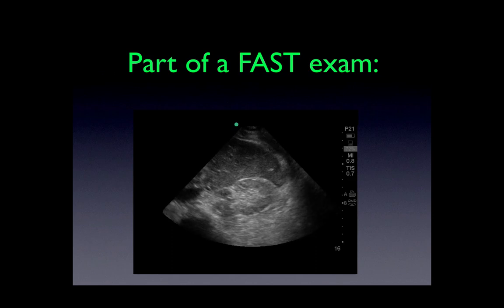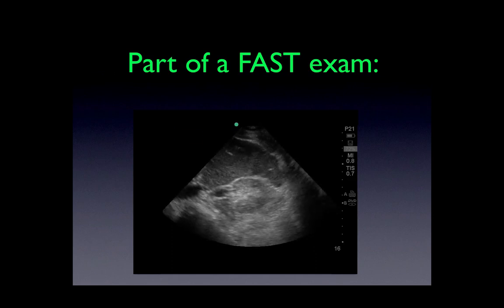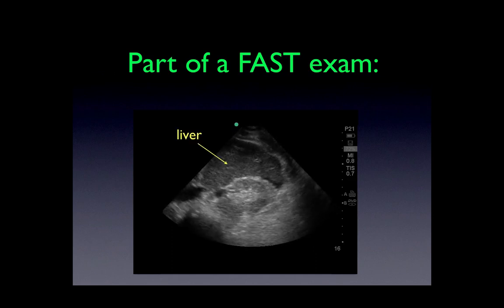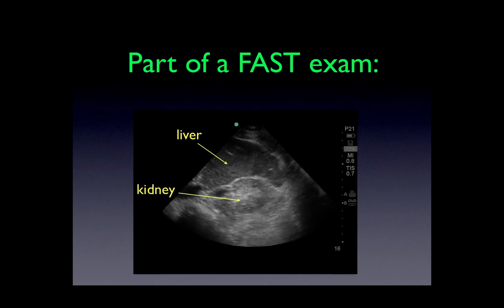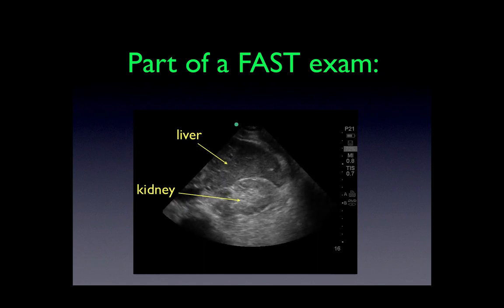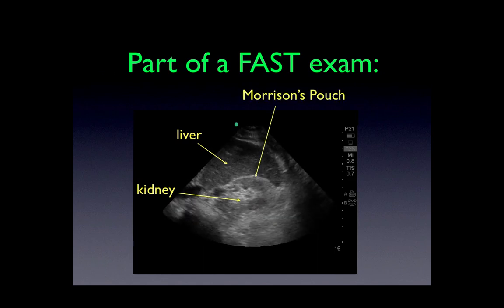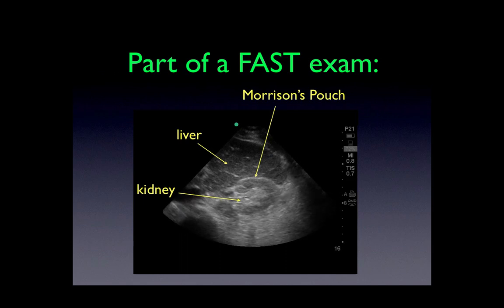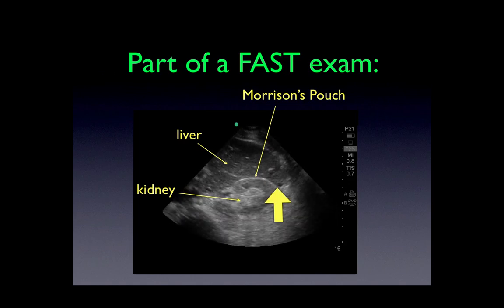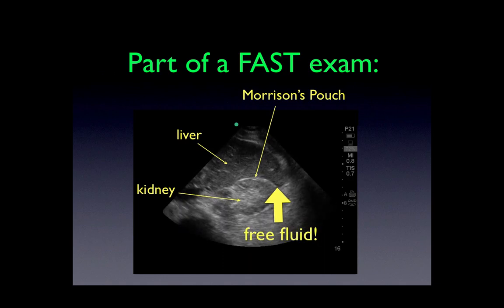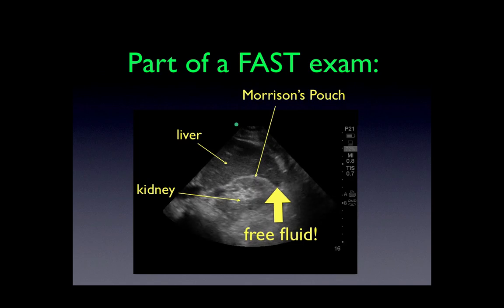Now we're seeing part of a FAST scan. The liver is noted to be more anterior. The right kidney is at the tip of this arrow. Morrison's pouch is the space in between. This is a potential space and there should never be an anechoic area, which would represent fluid. But yet there is free fluid at the tip of the FAST arrow — it doesn't belong there.